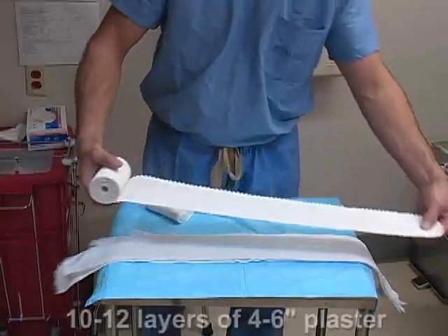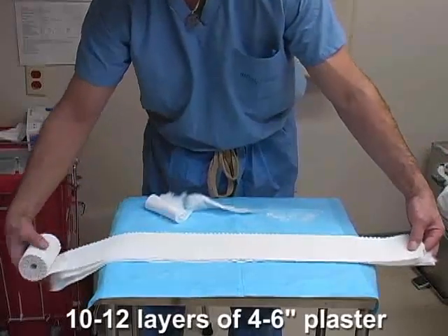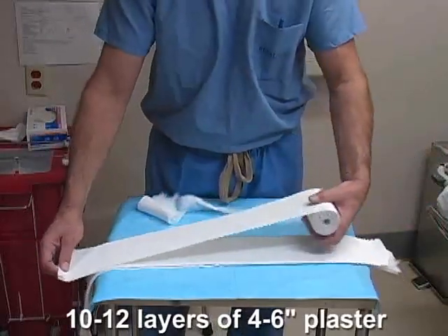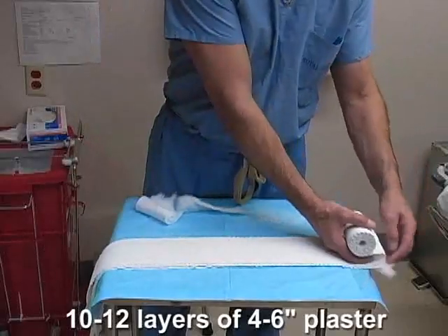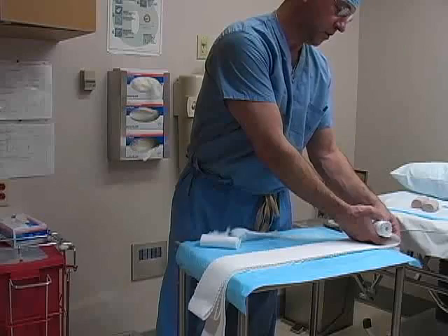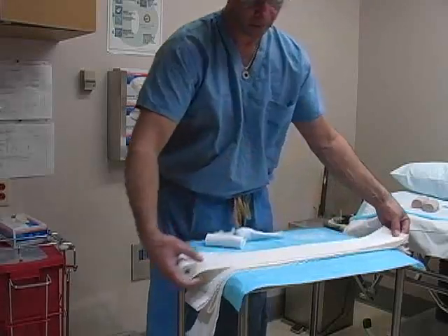Next, roll out ten to twelve layers of four to six inch plaster on top of the webril. The plaster may be folded back and forth upon itself during this process. Several rolls of plaster may be required for the coaptation splint.